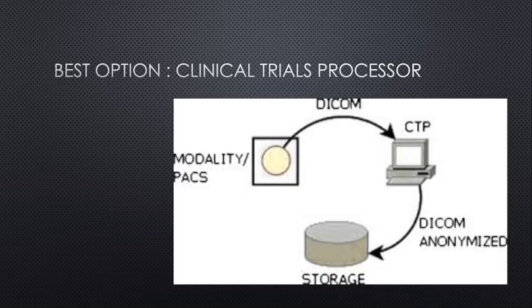It has its own lookup table, which we can configure within a text editor. It compares the PIDs and identifiers of the incoming images and references a table that we've provided. It will batch process these images that come in, and using the spreadsheet will strip any images.